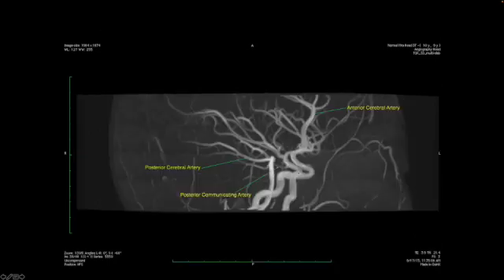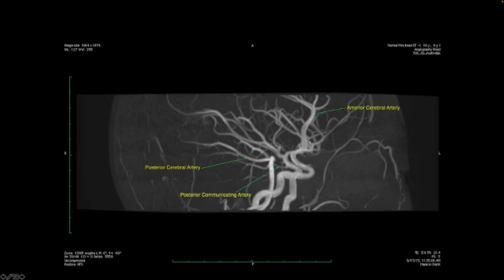Slightly oblique view of the same anatomy and a lateral view of the same anatomy. Again, the carotid arteries, the anterior cerebral arteries, which sweep up along the corpus callosum along the medial portions of the cerebral hemispheres and extend posteriorly. The middle cerebral arteries extend posteriorly to supply the majority of the cerebral hemispheres on both sides. And then the posterior circulation with the basilar artery and the posterior cerebral arteries.